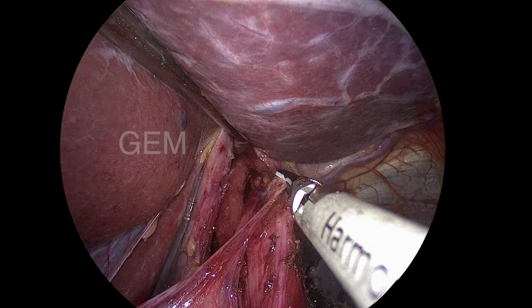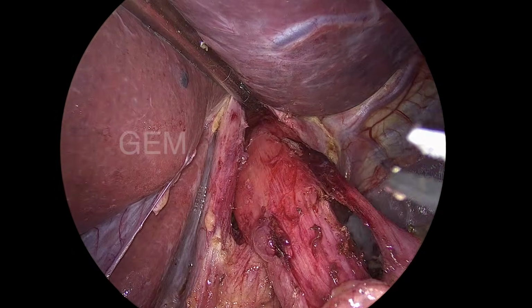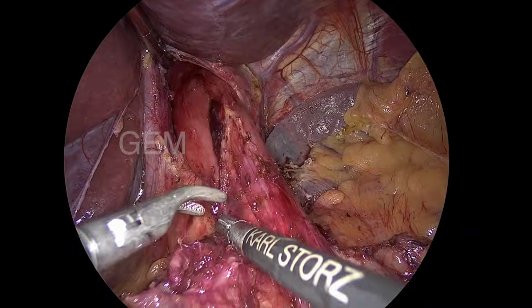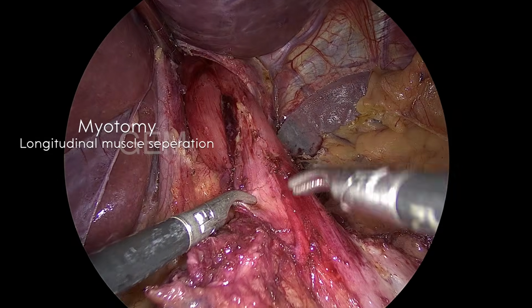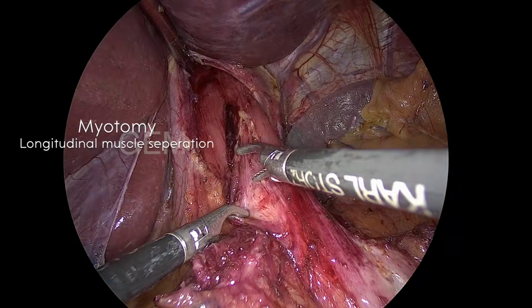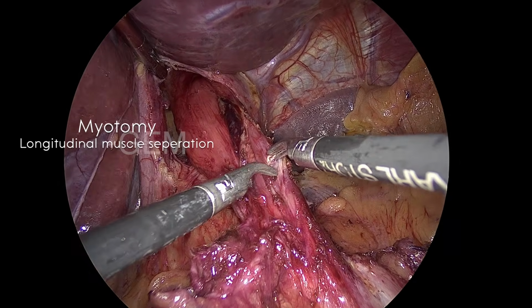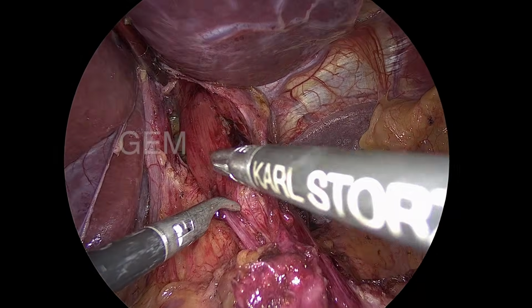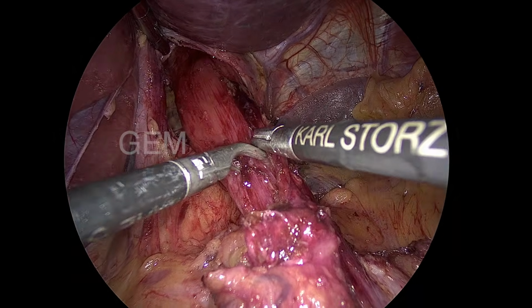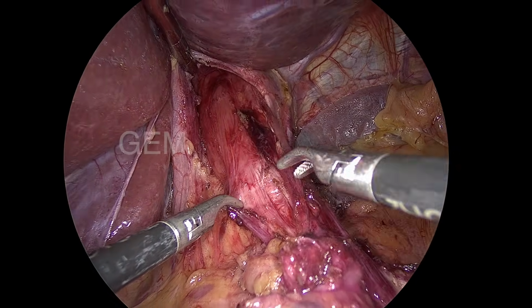So all the time I'm holding the fascial layer covering the vagus on the left side. Now I have started the myotomy, and in the previous video I used the cardiomyotomy scissor, the modified Sugarbaker cardiomyotomy scissor designed by Palanivelu sir, and in this surgery I am using only the Maryland monopolar dissector.